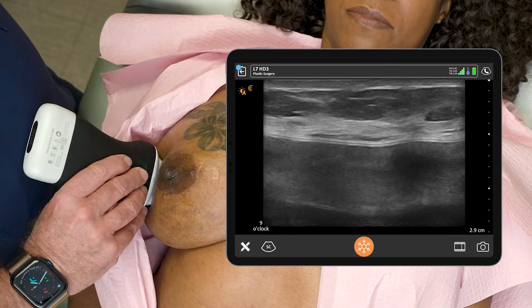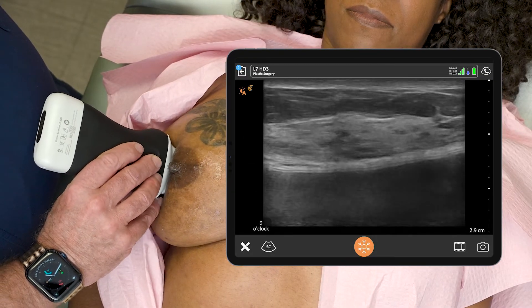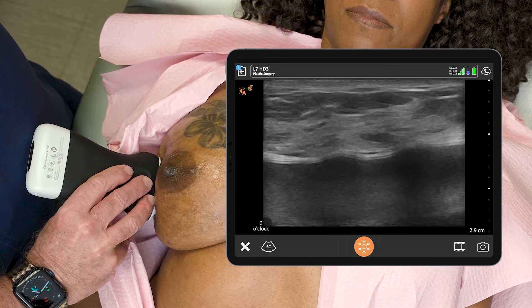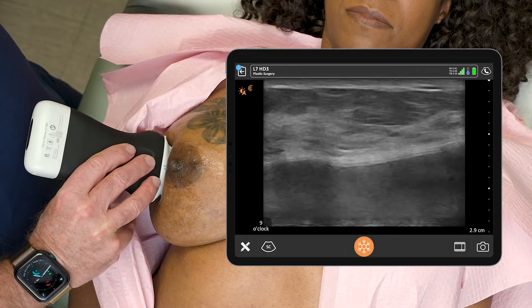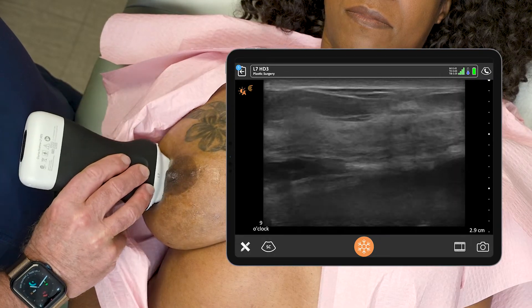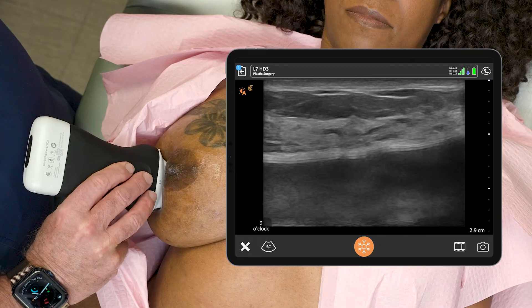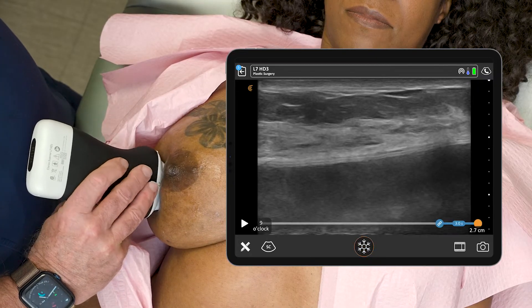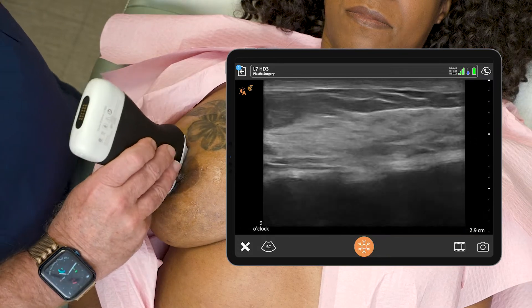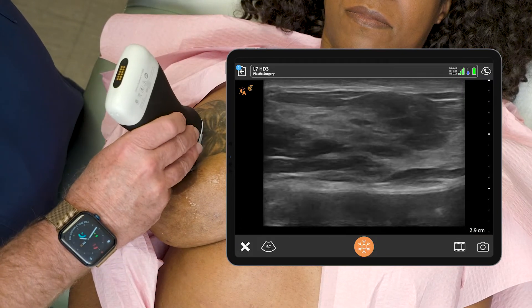It looks pretty good at 9 o'clock. I'm just going from the areola out to the base of the breast and coming back and forth. The place that it's suspicious is right up here at 12 o'clock. I'll get one more image at 9 o'clock, stop it, freeze that, save that, and then I'm going to go back to the 12 o'clock position because that's where the pathology was.